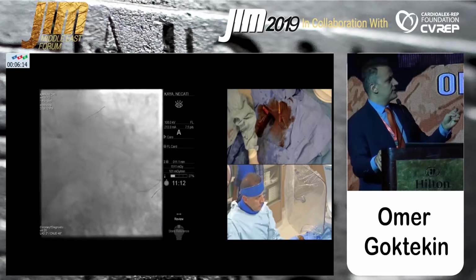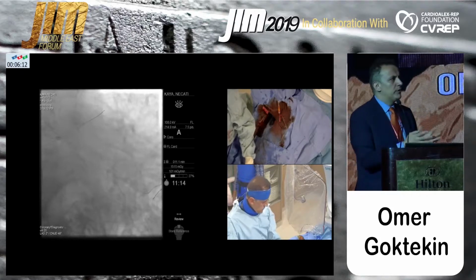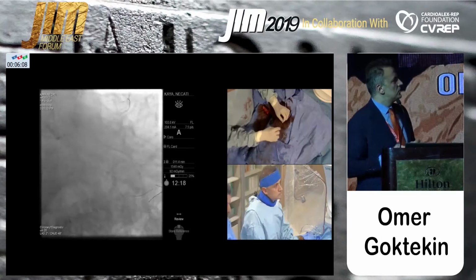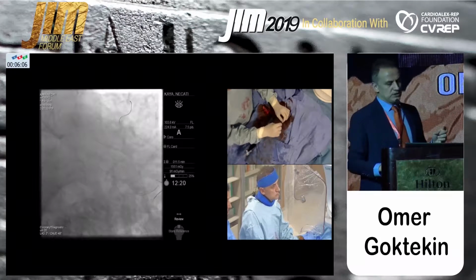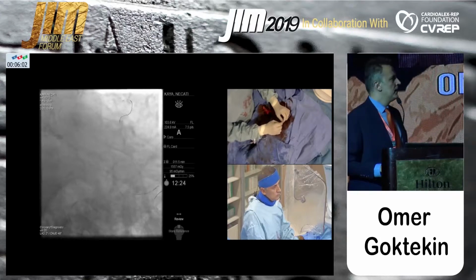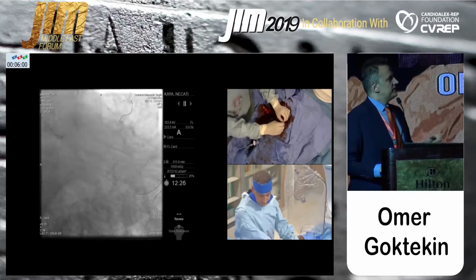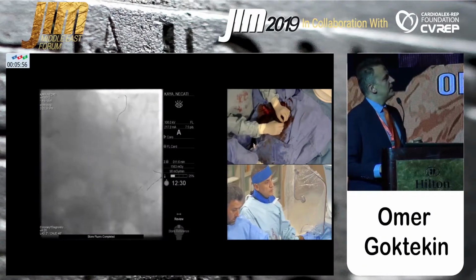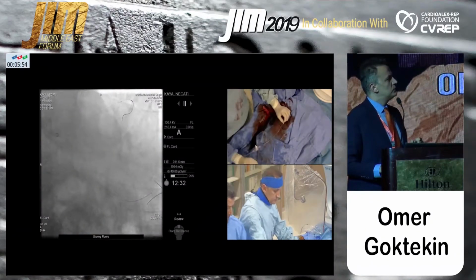I will show you something. I don't know if Dr. Colombo or other colleagues will agree. So now what I did, I wired the OM and I wired the small OM. After that, I had to do some ballooning. I sent first a 1.5 balloon and I did dilatation.